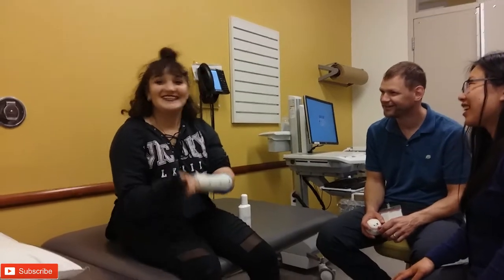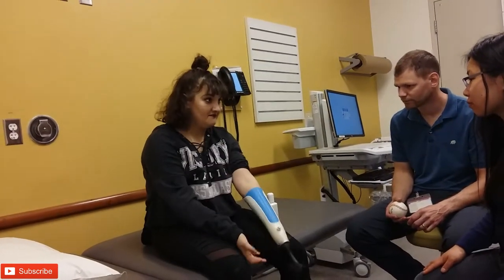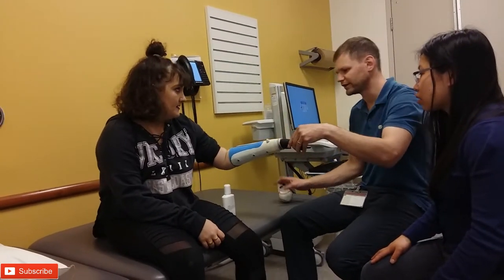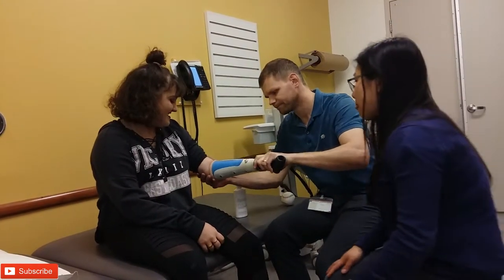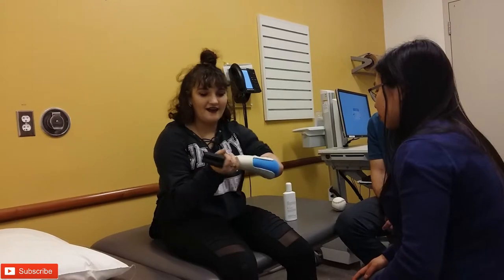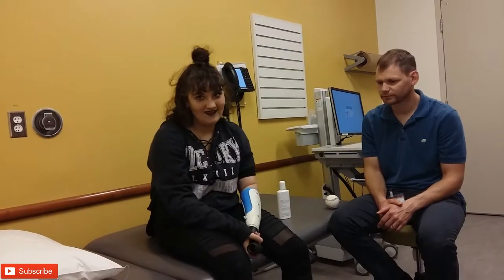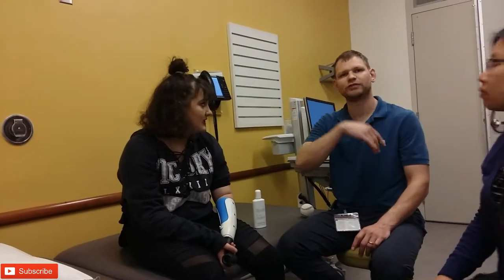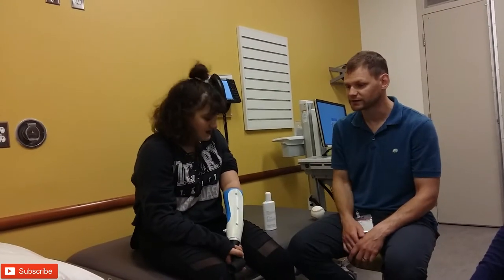Yeah, this is the bat one thing. Is it heavy? Yeah. Do you want a cover? I imagine it'll be a lot heavier with the bat. Can you hold it on? Do you think it will stay on? I know you can let it come off, but can you hold it on a little bit? That's a little slippery. Try and hold it on your hand — it might come off a lot easier when you swing the bat. Yeah, so I'll have to hold the bat anyways because this is my stronger arm. There's a technical flaw we found out about two days ago, but because we had the appointment we wanted to check everything to make sure it was good. We're going to have to remake this.